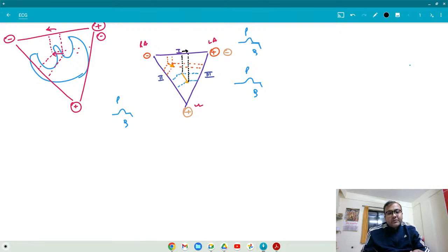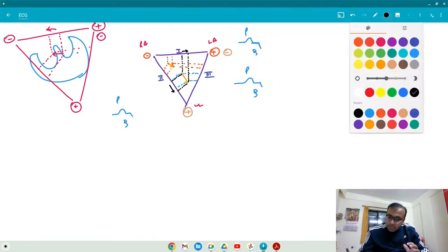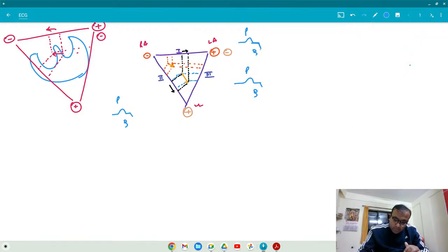This is the magnitude. In a vector, length determines the magnitude. So if you compare it with, say, lead 2, what do you think? Is the magnitude remaining the same? Now agreed? That means I can put it somewhat like this. Right?